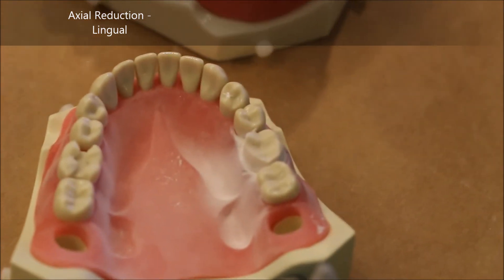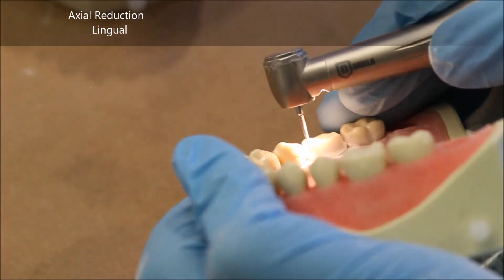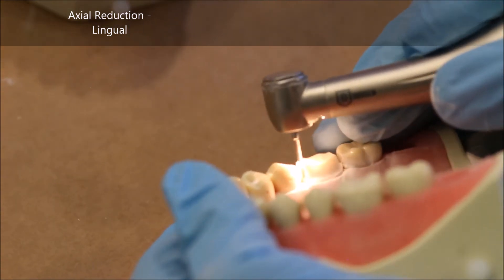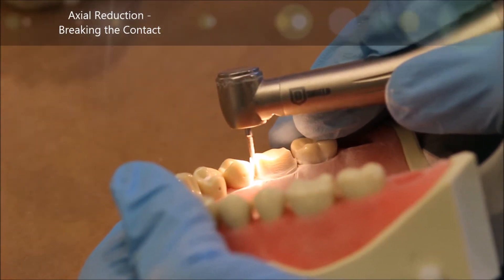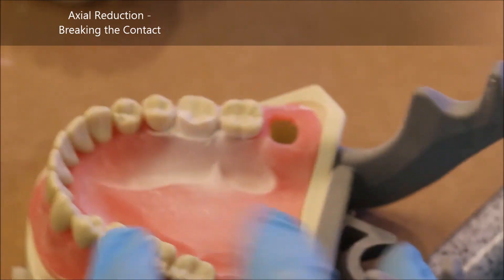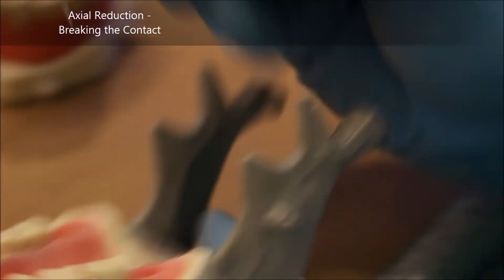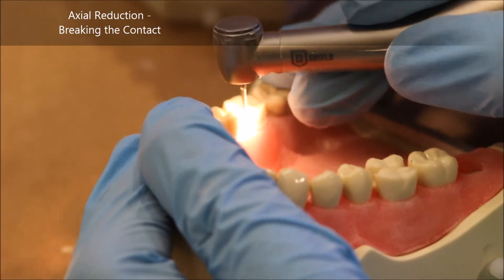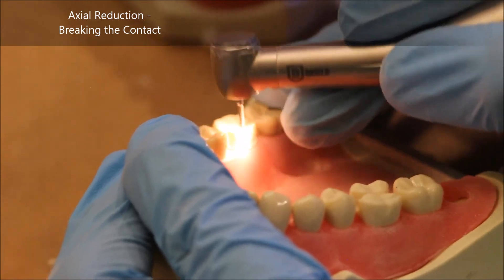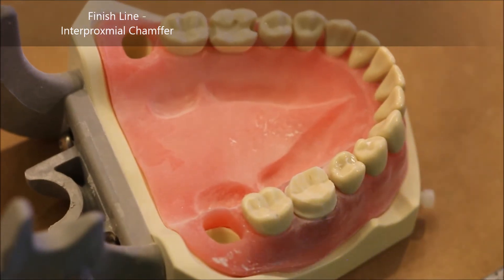Having completed the distal interproximal contact break, I'm now going to work on the mesial again with the 850 burr. Having mostly completed it, I'm simply refining my axial walls. Since the contact has been broken through, I switch back to my 878 in order to make the interproximal area chamfers as well.